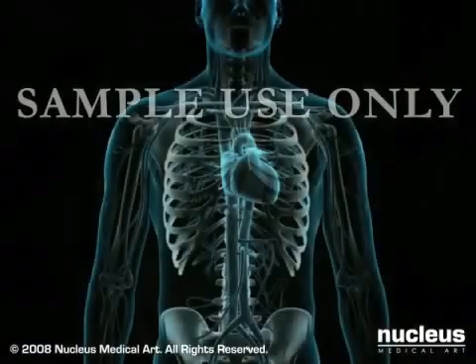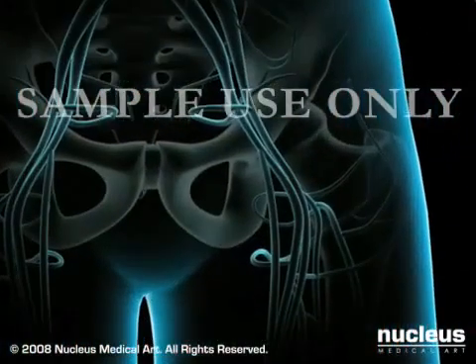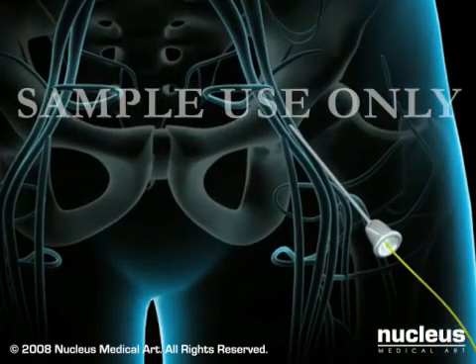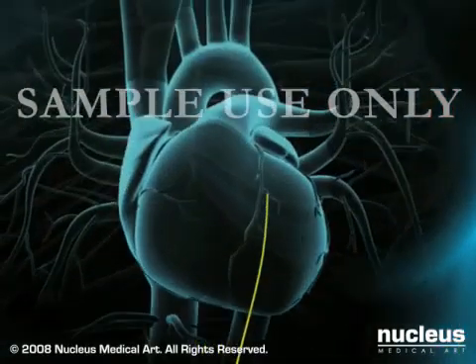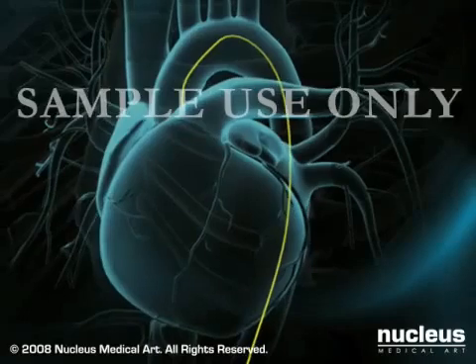Most cardiac catheterizations take place through the femoral artery in the groin, but can also be done through an artery in the arm. The doctor numbs the skin in your groin area and inserts a needle into your femoral artery. Once the needle is placed, a wire is passed through the needle and gently guided through the arterial system to the heart.